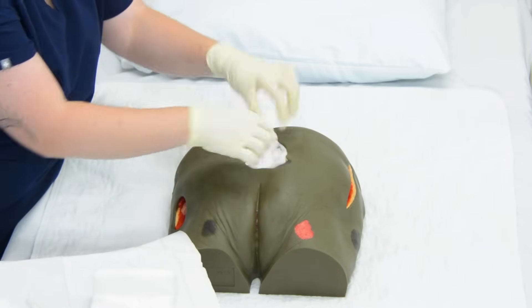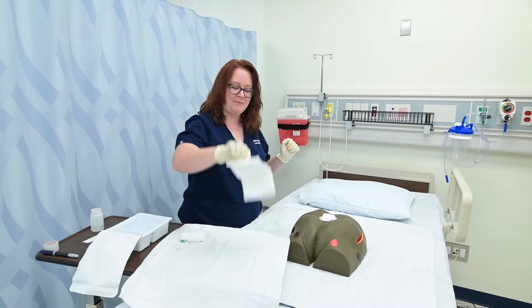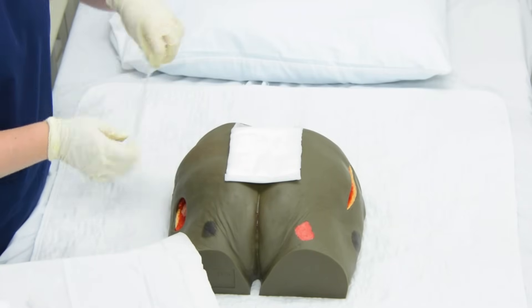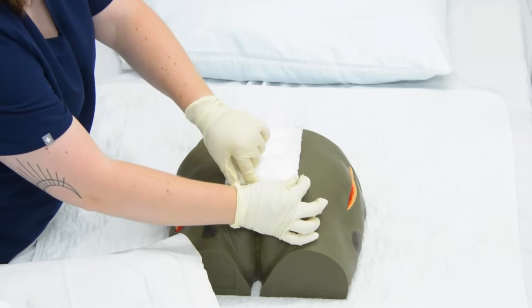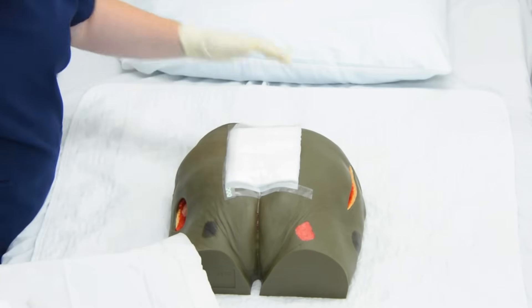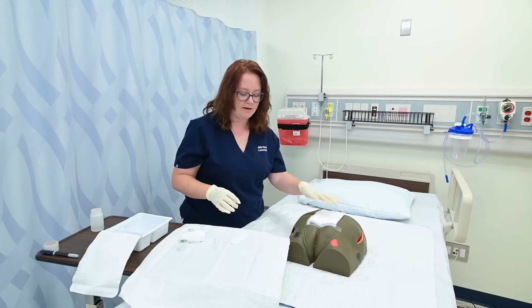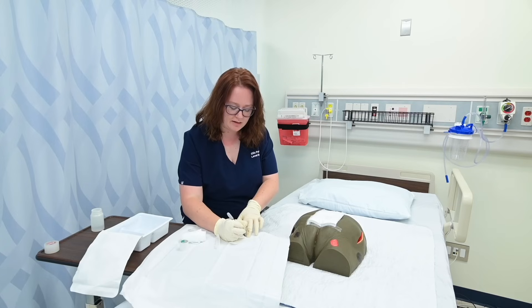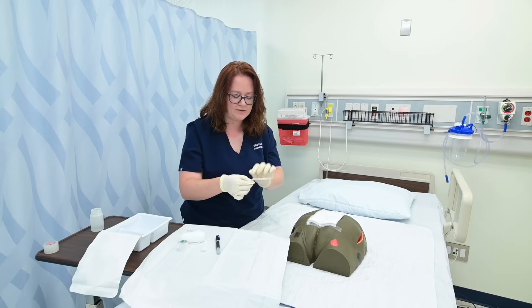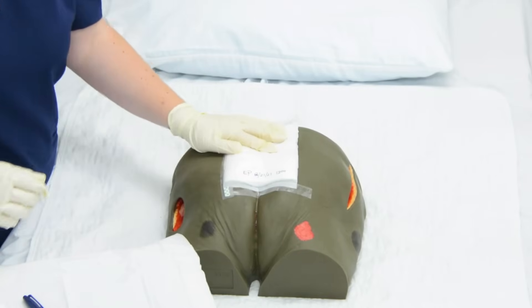We're going to pretend I have enough gauze to actually fill this wound today — that's full. Then I take this ABD pad and place it over the wound, and then I take my tape and occlusively tape it so that it's secure to my patient. I would tape all four areas, and now that my wound is covered, I no longer have to really worry about sterility. So I'm going to document my name, the date, and the time.